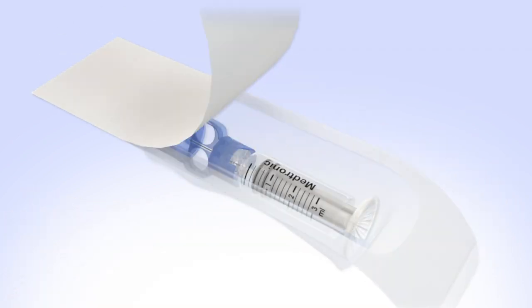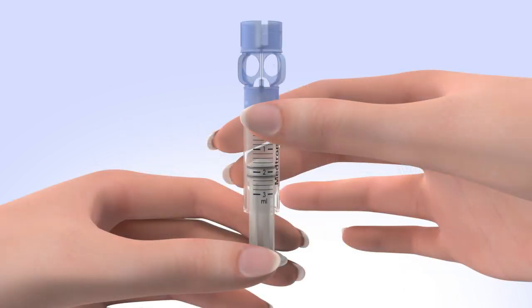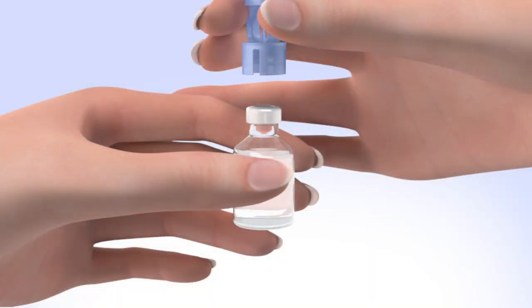Remove the new reservoir from the package. Pull the plunger so the top o-ring is positioned at the amount of insulin you plan to put into the reservoir. Be careful not to pull the plunger completely out. Hold the reservoir by the blue transfer guard and connect it to the insulin vial by pressing down.